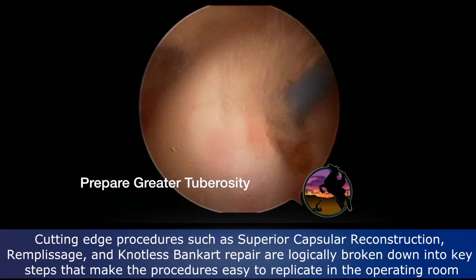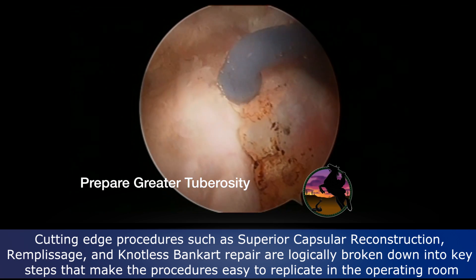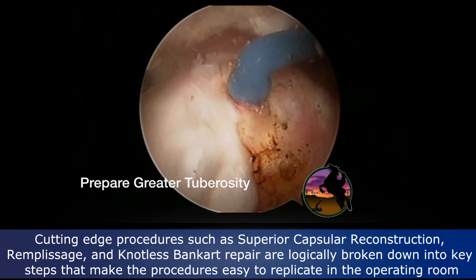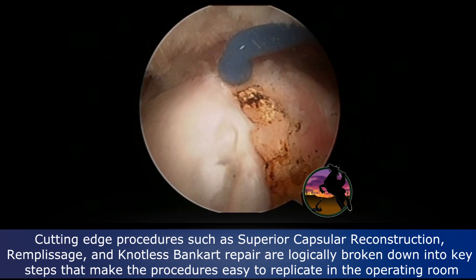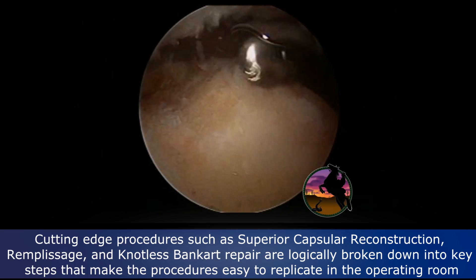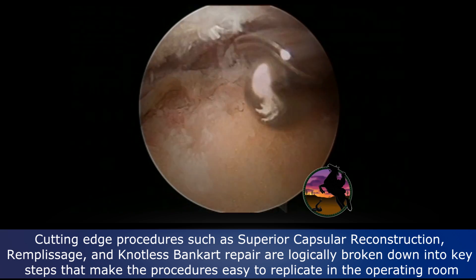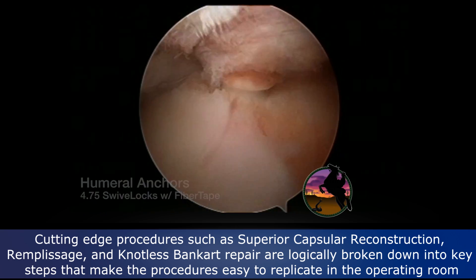On the greater tuberosity he's got some adaptive changes — beginning to get some femoralization of the proximal humerus — so we have to outline the articular margin. That can be a little difficult to tell sometimes, but we recontour it so we have some semblance of a greater tuberosity again.